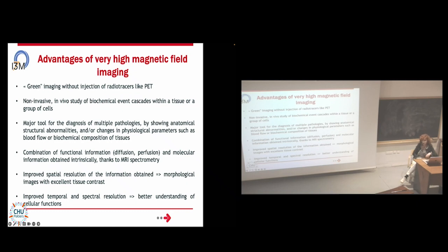But of course, the problem of noise is very important, and that means you need pre-treatment before the full analysis, before the extraction of characteristics. In MRI, pre-processing is really important. The best-known process is to have an average of different images at different times, and so you eliminate the Gaussian noise. But before making an automatic analysis, generally you have pre-processing of the data to remove the noise due to motion of the patient, or something like that. If you stay 1 hour and a half in the machine, you can move during that time. You don't have to stay in apnea for 1 hour and a half, but you're right, motion noise is a problem.